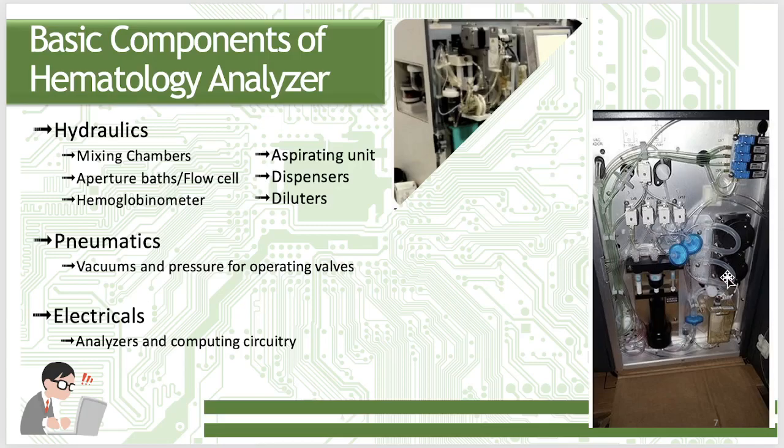You know what, guys? If there's something wrong with the machine, of course, there are engineers naman for that particular machine or company, no? Usually, binibigyan lang kami ng contact number if there's error. Kasi usually, nag-error, maglalabas siya ng particular na warning na there's an error on this particular part sa display. So, if we cannot really do it on our own, of course, we have to contact the engineers of their company. But still, we have to be aware or knowledgeable of the basic components of your hematological analyzer.